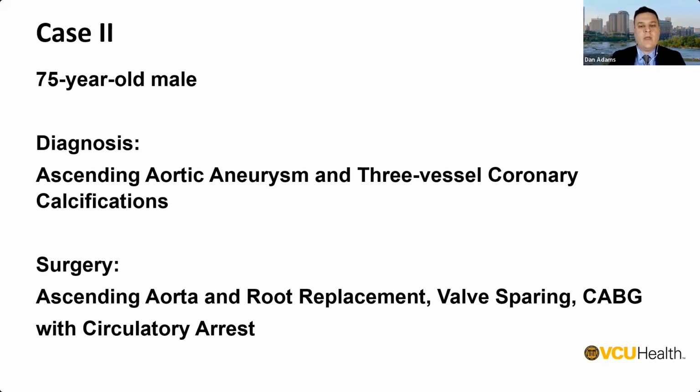aorta. In this case, it is important to note the special technique that was used was antegrade selective cerebral perfusion via the innominate artery.